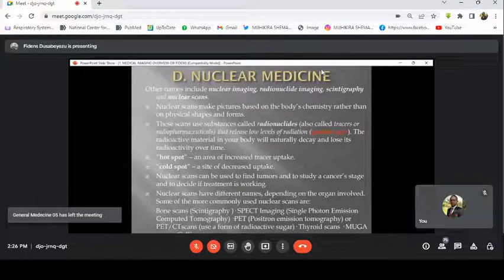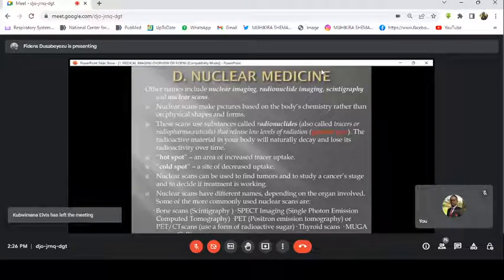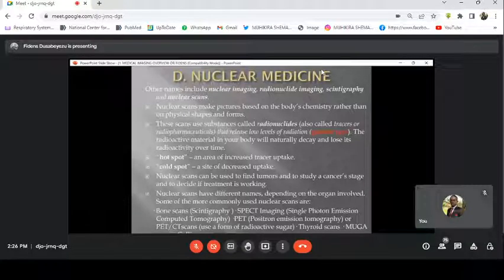Remember, this lecture is about overview of medical imaging. What's being done there? What do we have? How can you select? I want to do this and this and that. Okay. So we go now to nuclear medicine. We don't have nuclear medicine in Rwanda, but it happens. Sometimes we send patients outside the country for nuclear imaging.